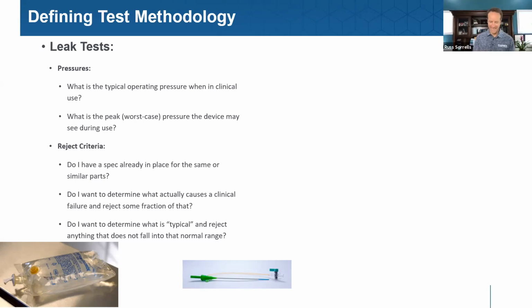Certainly. A huge number of our customers do delta P, and we're fine with that as long as we coach you and advise you. Whatever you do, don't have 5 different parts of 5 different volumes and try to reject the exact same delta P pressure change value for all of them, because on the little ones, you're going to be acting very restrictively. On the large ones, you're going to be allowing a lot more liberal leak or loss, and you will not have a level playing field. Absolutely.